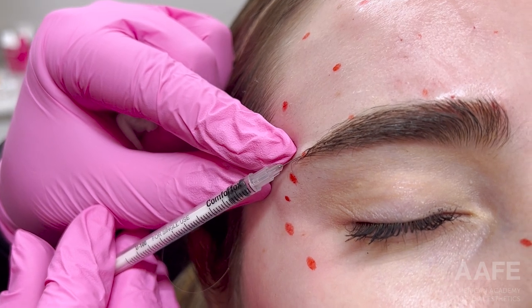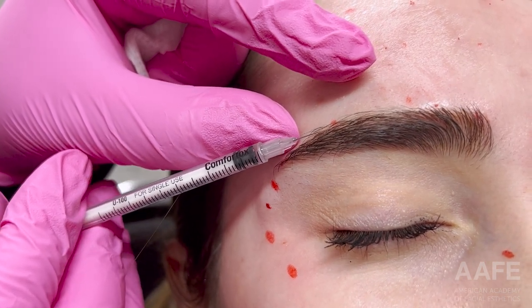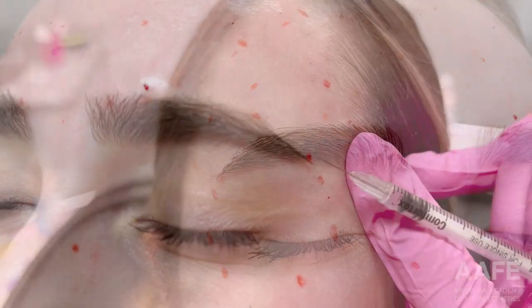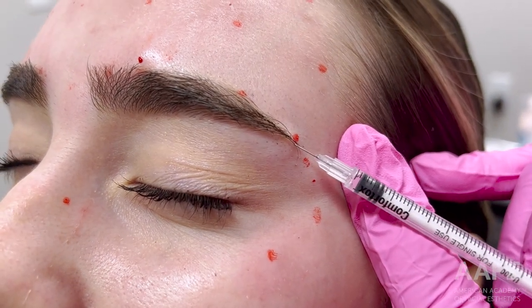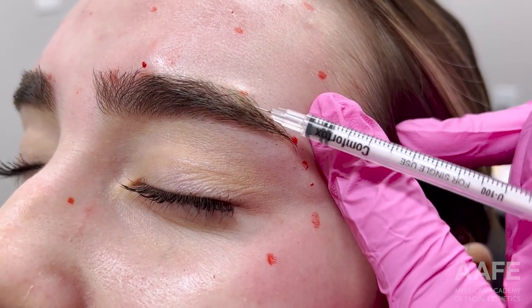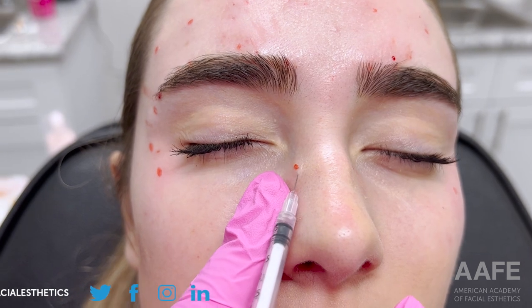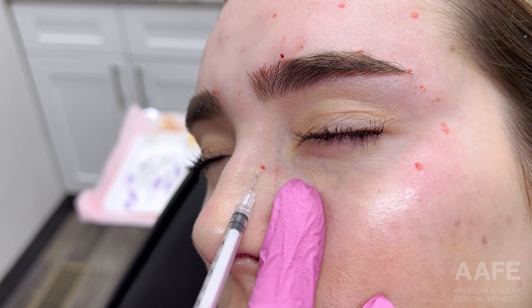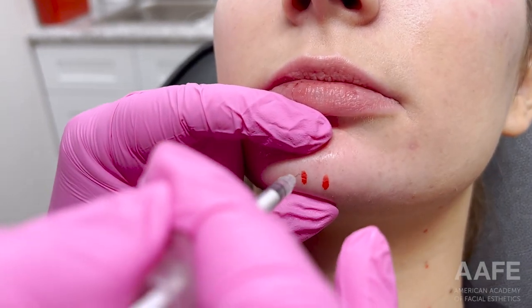Just did her crow's feet, now I'm doing a little bit of a brow lift. I like to use a tight dilution when treating the brow because it is such a specific injection — you have to be extremely superficial to ensure you're not going too deep and injecting the frontalis, because then you'll really drop her brow. You also don't want to use a lot of volume because it may diffuse down to the frontalis and give her some heaviness or drop. Use a tight solution, very superficial injection.